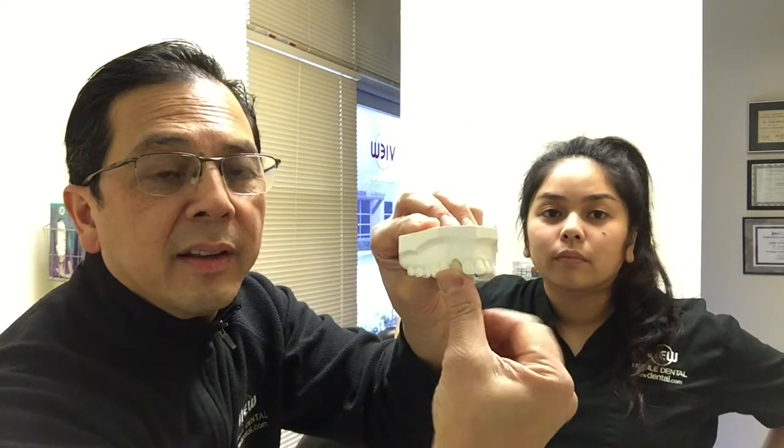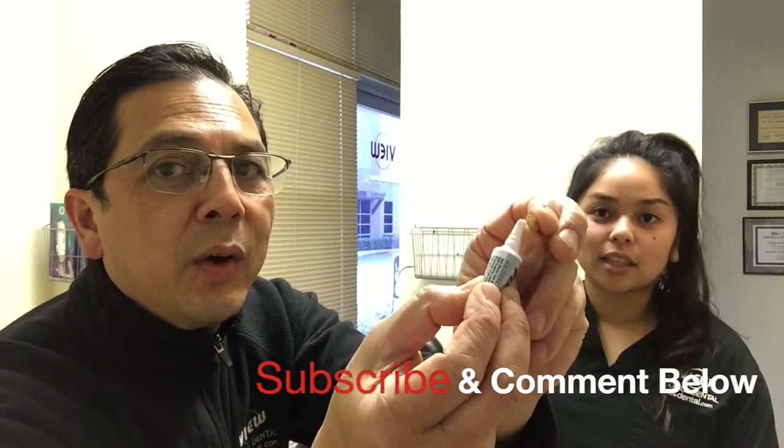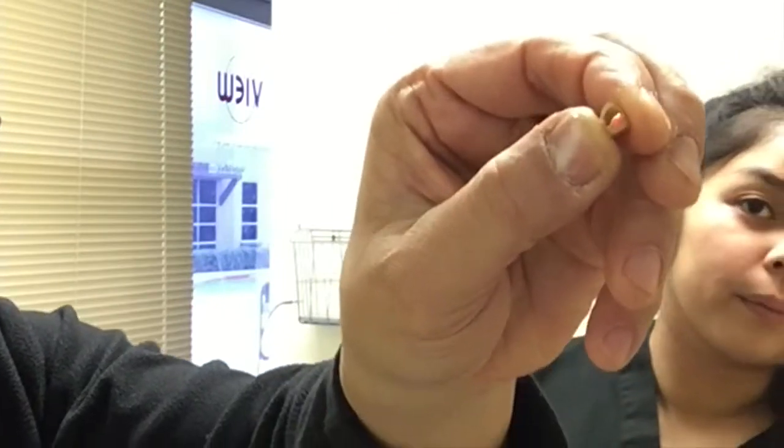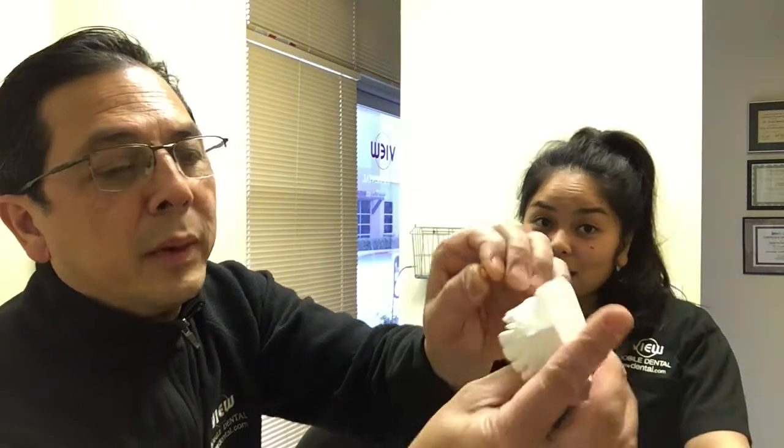Now you've got one tooth that's missing and you want to put that back just like that — just one tooth. So we're going to go ahead and put this back. You're going to put a little bit — not a whole lot, see how that looks? Just a little bit. And then you could put the crown right back.